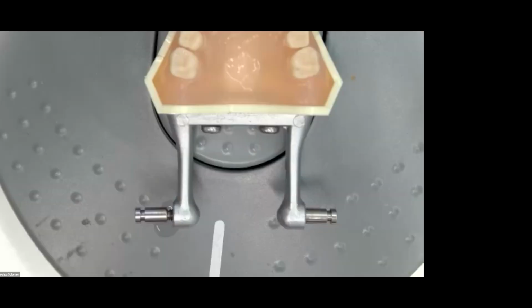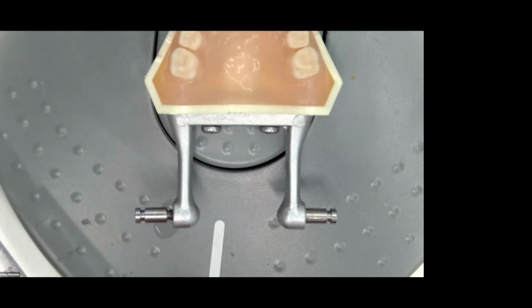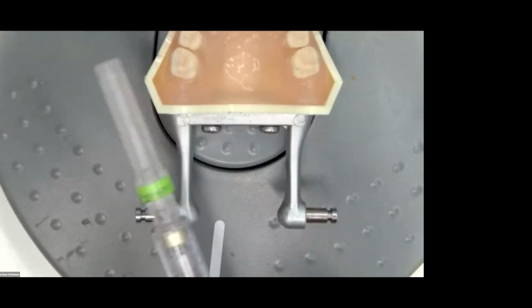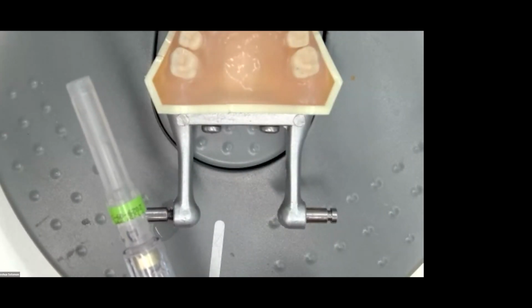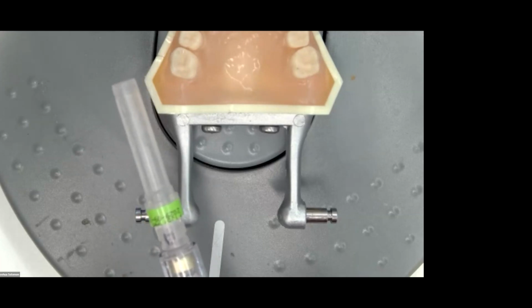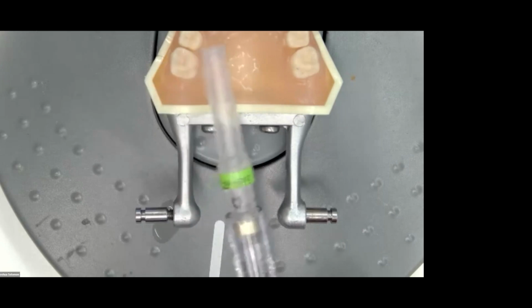You know what? I showed you that photo earlier about the tip of the needle is slightly bent after the first use. I'm just changing it out every single time. It's not worth saving. I mean, what are you going to save, like $100 for the entire year trying to reuse these guys? You have a better chance of no sensation given your patient whatsoever, and easier manual bone penetration with a new needle every single time.